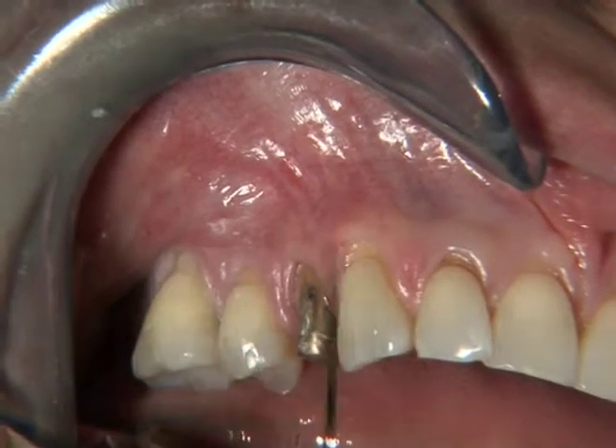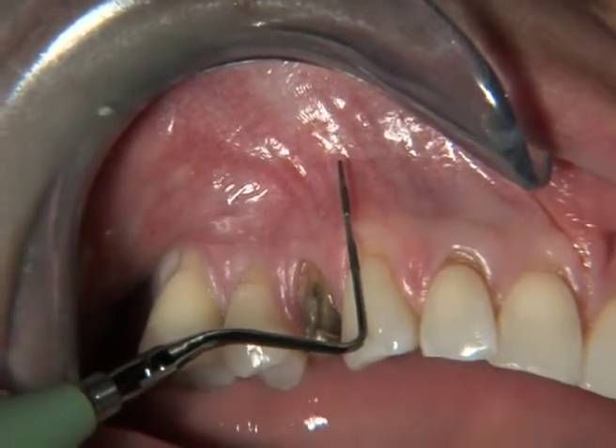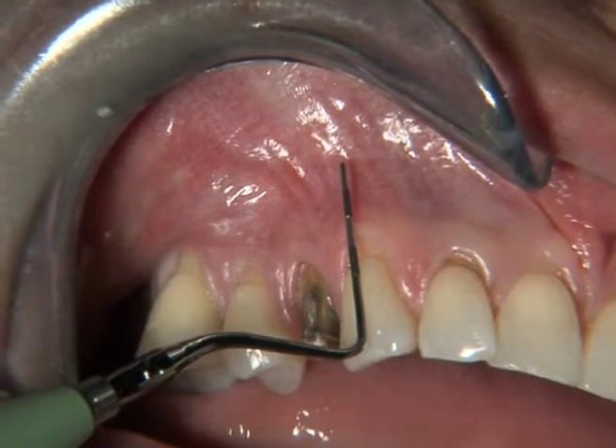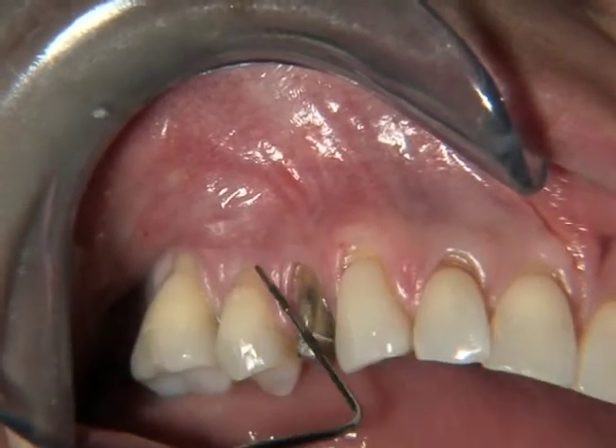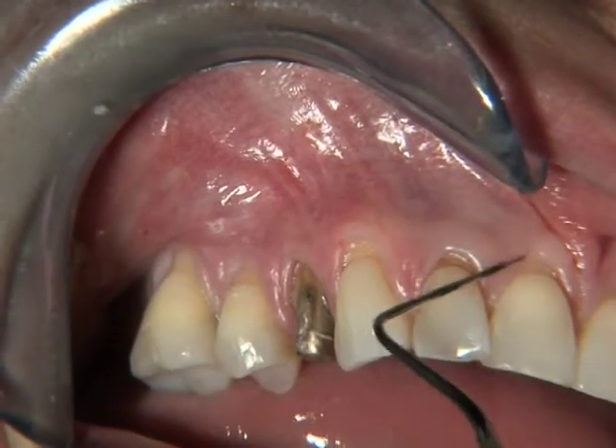The incision will be directed toward the canine, which is the midline of the flap, and every single incision will be directed towards this tooth.